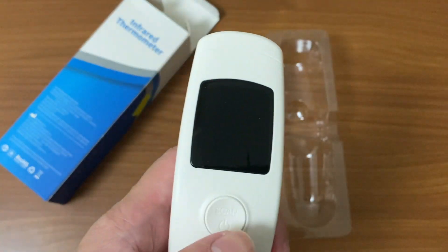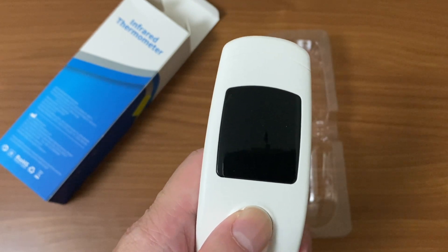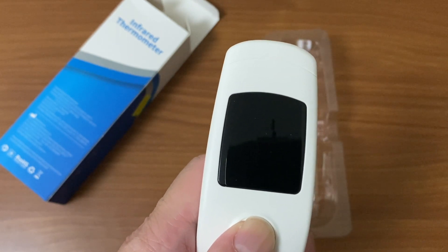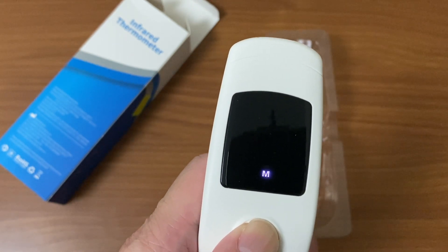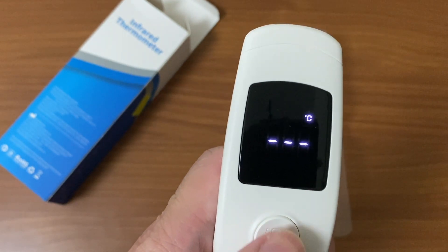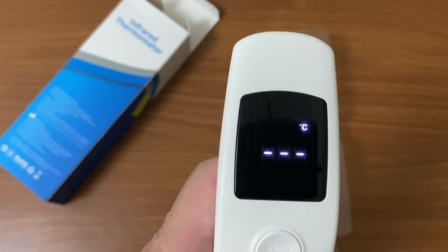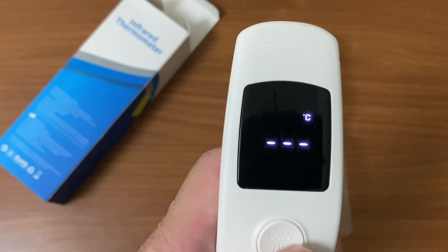Here is how you change from Celsius to Fahrenheit or vice versa: press and hold this button for eight seconds. Once you see three dashes, it shows Celsius or Fahrenheit. Release, then press again to toggle between them. For me, I'm going to keep it on Celsius.